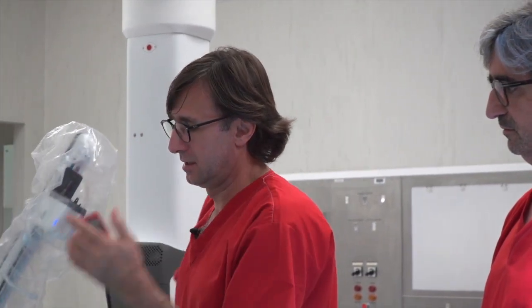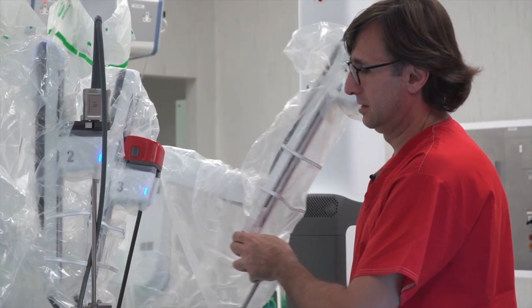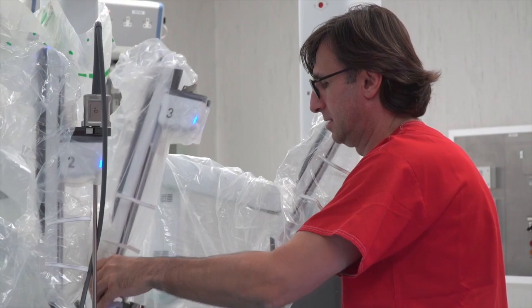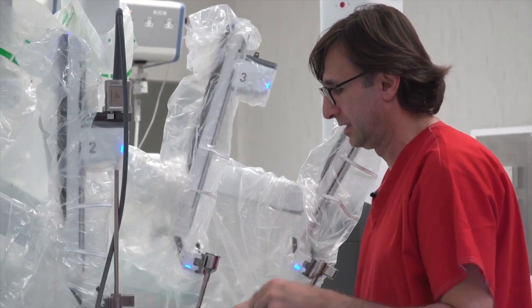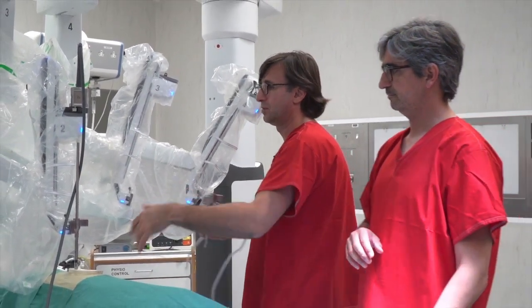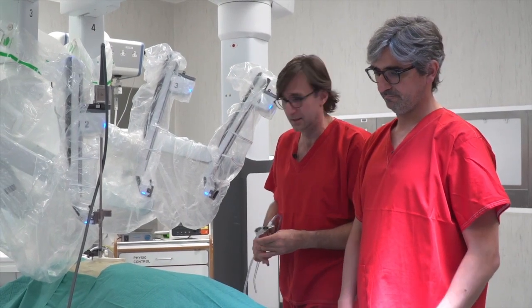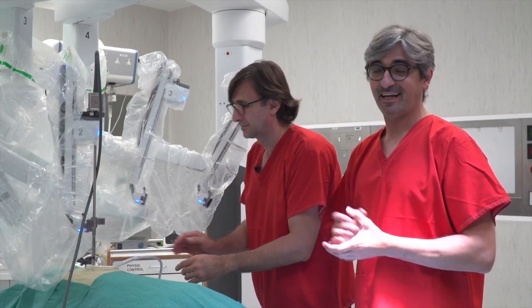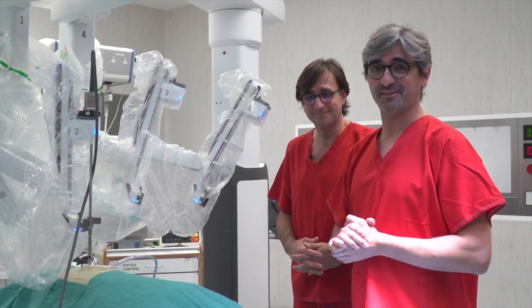This is how we set up the robot, how we put the arms. It's a very quick docking — one to two minutes. And also, undocking is very, very fast. For example, you want to undock: this one out, put this one aside, this one out, this one out — and you are undocked, ready to take action if you have a problem inside. Fast. Changing the ports, moving the robot, it's easy. This is how we set up the ports in uniportal RATS. Let's see with the patient a more interesting video. Thank you.